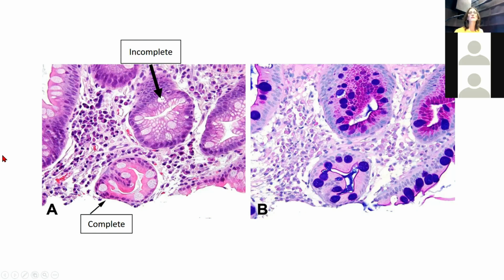So it's actually quite easy to do on the H&E. I have a feeling in the next few years, there's going to be tremendous pressure. The trouble is that I know when I see these cases, there's often both. And so in theory, you'd want to quantitate. So it's a little bit of a bogus thing because the colleagues have other ancillary ways to look at this, but it will be coming and it's very easy to tell them apart.